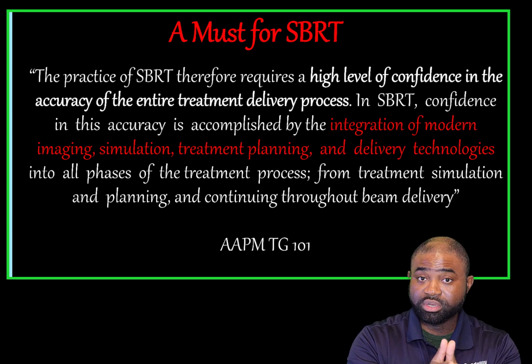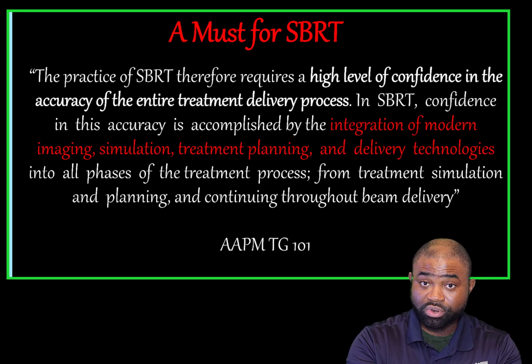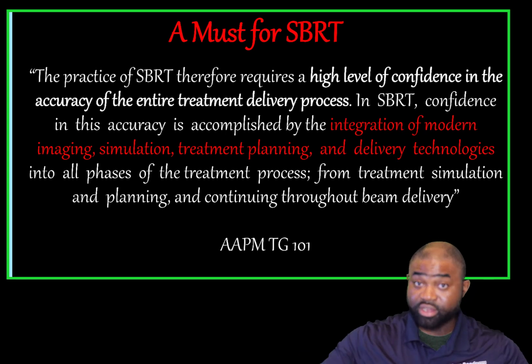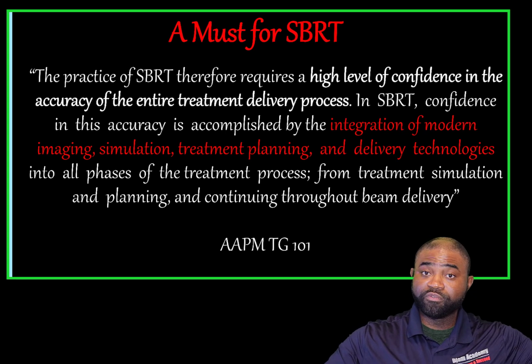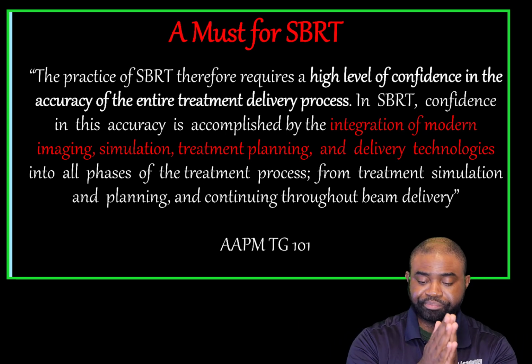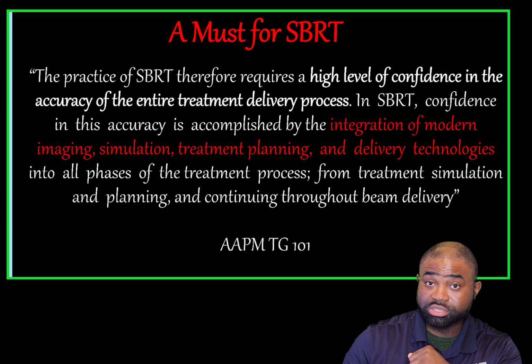In order to assure this accuracy requires the integration of modern imaging technique throughout the entire treatment process, from simulation to treatment delivery.